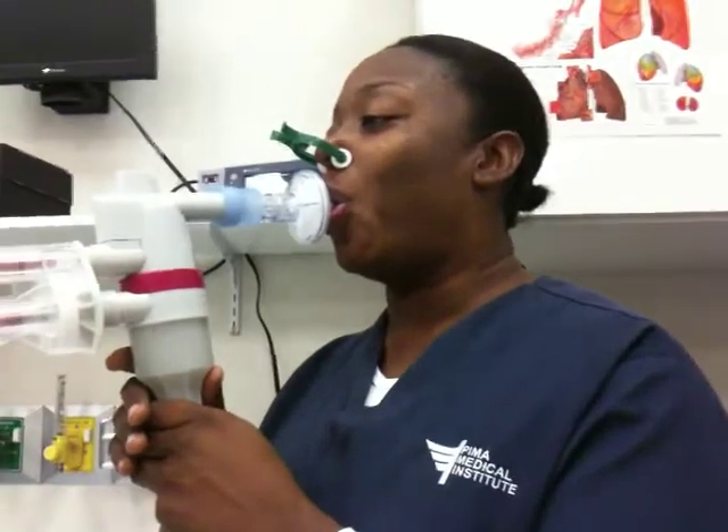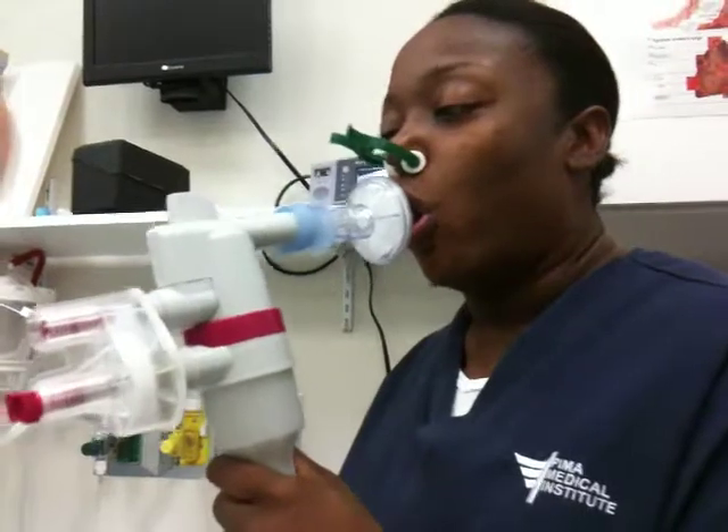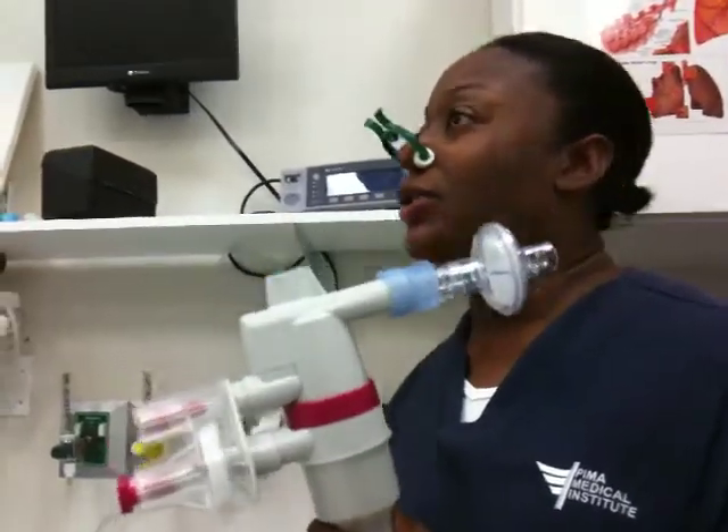Now we got some action going on here. Now control the clapping cheeks. You look like you're skydiving. You can feel my head. Exhale. Inhale. Can you inhale and exhale on this, or can you just exhale?